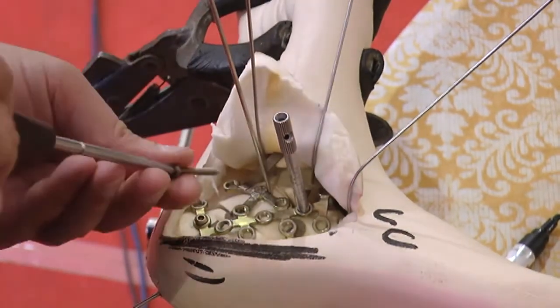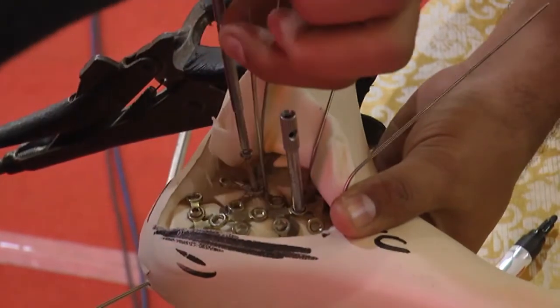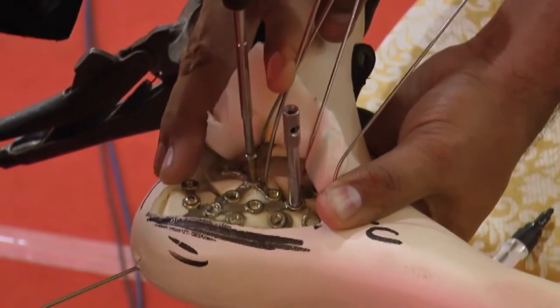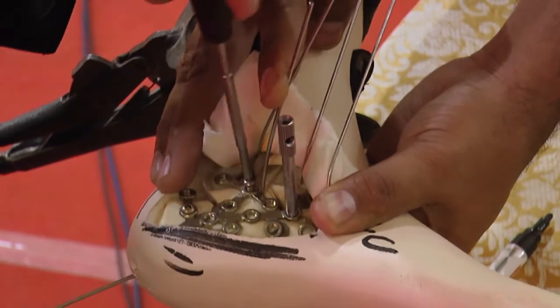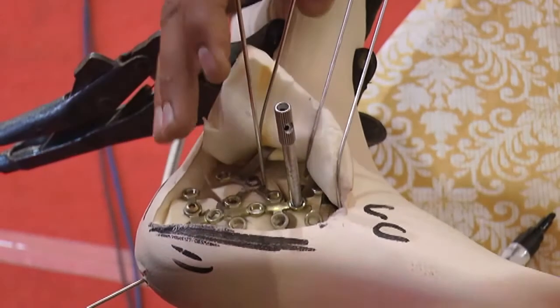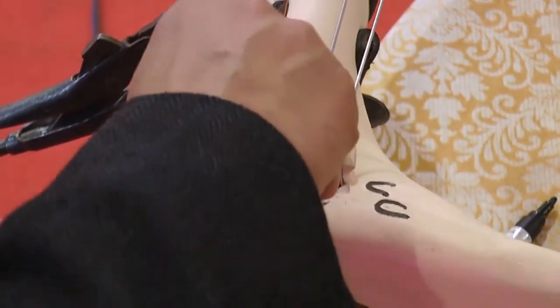One cortical screw in the anterior process, and then one locking screw in the tuberosity, one locking screw into the anterior process, and maybe one into the center of the body. So 2 screws per fragment should be enough. And again, this screw progress is monitored in the axial view. Obviously, if your drill has gone in the right direction, the screw will follow the path. So I'm not going to show the other screw. I think it's simple. One screw here in the anterior process, and then I'll use the locking tower into the tuberosity here, and one screw maybe into the body here, and one screw into the anterior process.